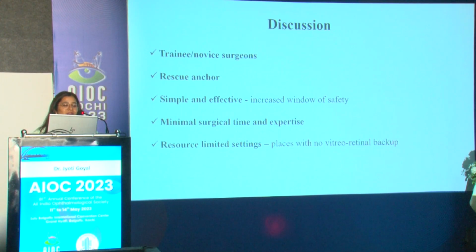It requires very minimal surgical time and expertise, and this is very useful especially in resource-limited settings, places where there is no vitreoretinal backup. This technique can be a saving technique.